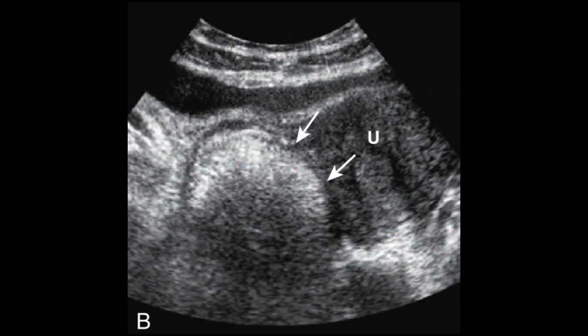While you are scanning the patient from the abdominal area, make sure and confirm that you are not confusing it with the bowel loops, because bowel loops will give rise to the same appearances. The only distinguishing point would be that you palpate the area with the hands and find out whether any mass is palpable or not. If there is a mass palpable, put the probe on and find. If you can still appreciate this tip of iceberg sign, then it is confirmed that this is a dermoid lesion.